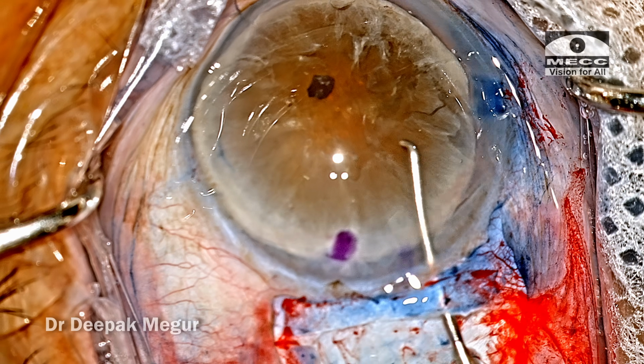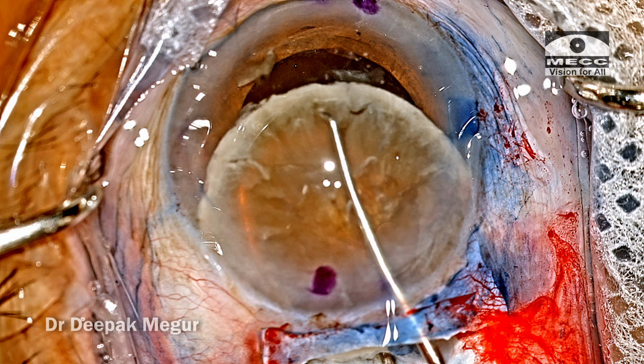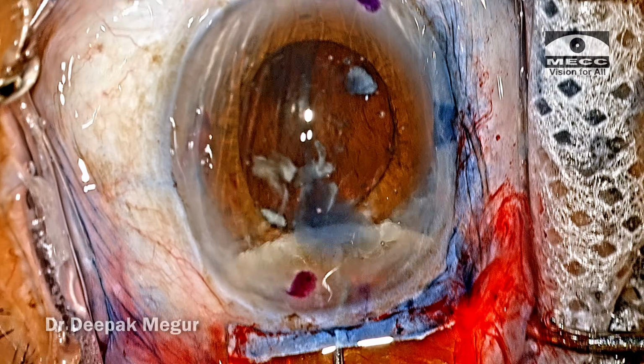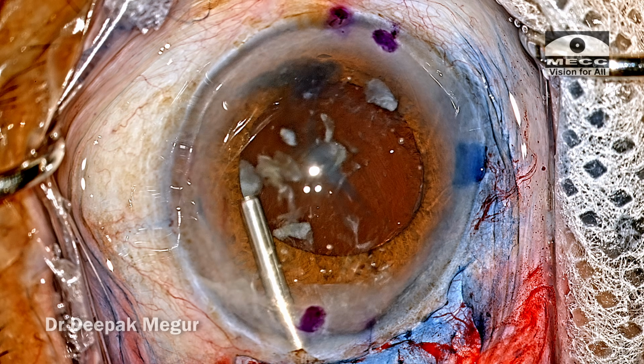The dialer goes in first, followed by the vectis. The dialer compresses the nucleus down so that it is squeezed in between the vectis and the dialer, and the entire complex is now pulled out of the eye. So the nucleus extraction was quite easy and safe, primarily because of the bigger incision which we had created. The cortex needs to be removed.